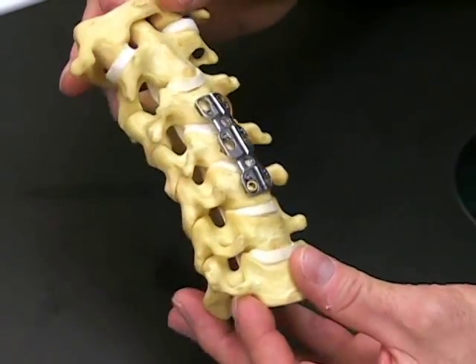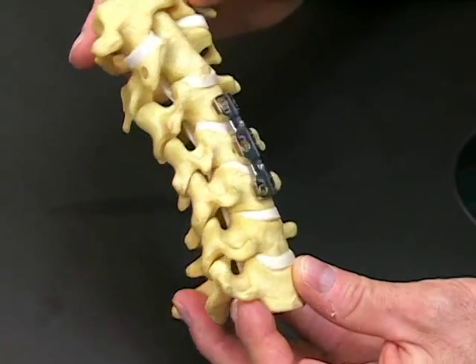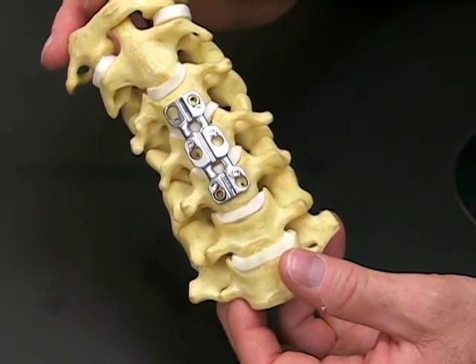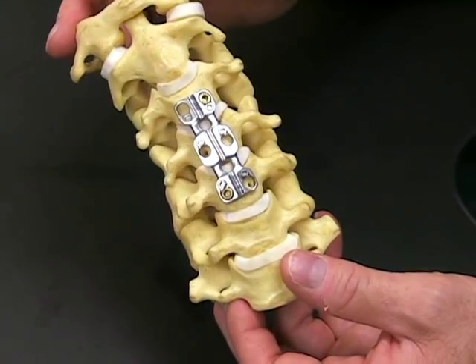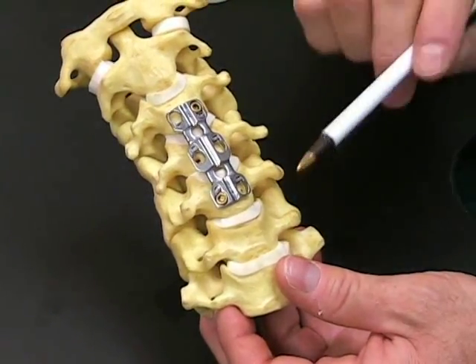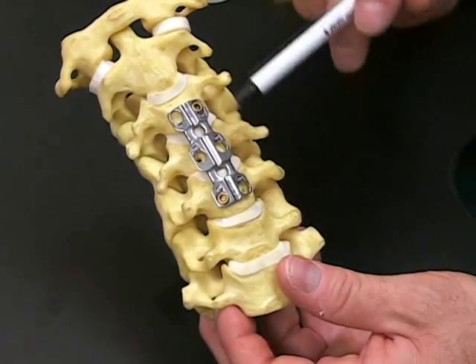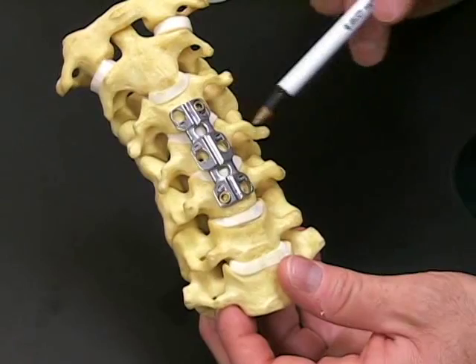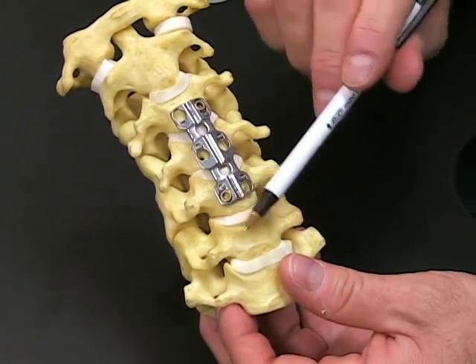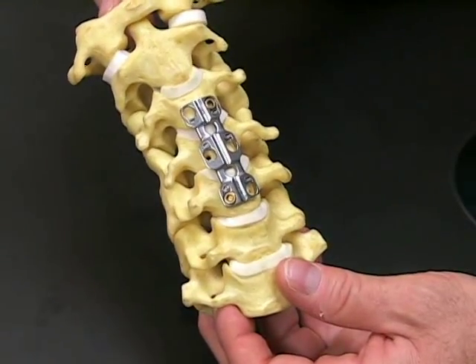But this plate is a thin plate. It contours to the shape of the neck, and it doesn't interfere with swallowing, etc., and generally we'll leave this plate in after the operation is done. However, if there was a disc problem, say at this level or above, then this plate would be removed, providing that everything had healed properly, and then a similar operation would be done at a lower level, putting perhaps a smaller plate at one level as well.